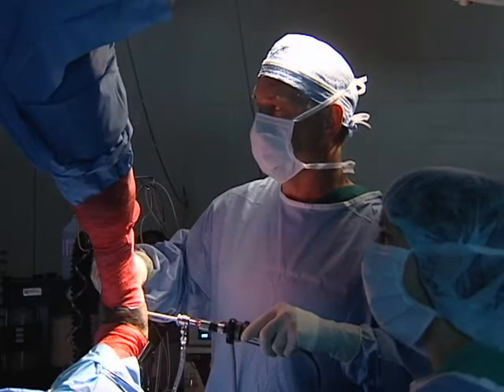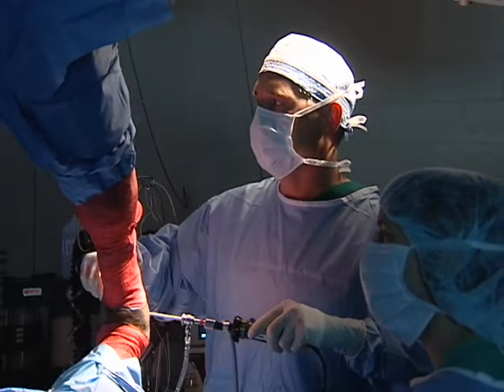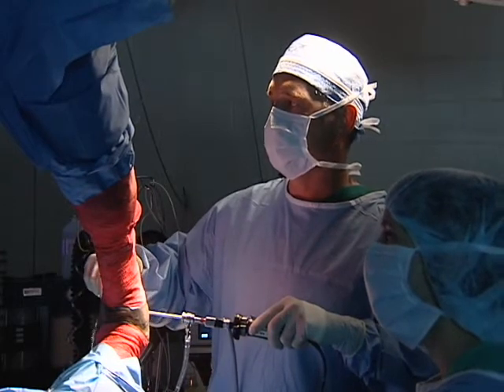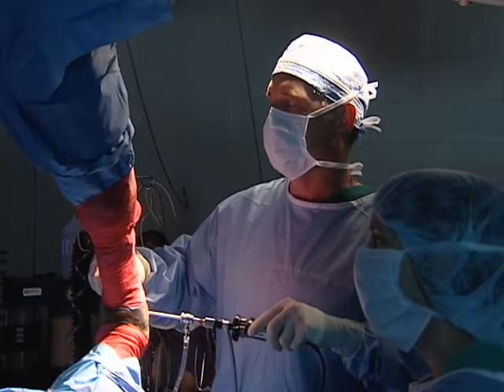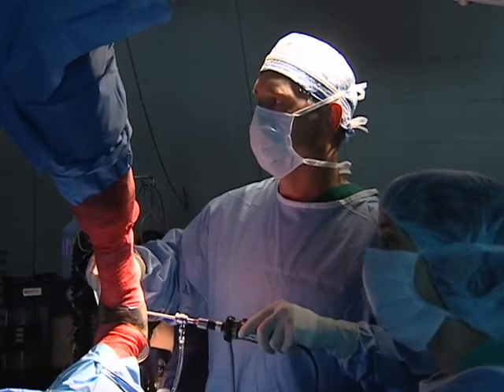This is just abnormal cartilage. All this fuzzy appearance is abnormal. It's cartilage that has been broken down due to, one, that bone fragment that was in the joint, the inflammation, and other changes that have been going on in the joint. And so it's not doing anything of any significance to help support that joint. So we'll remove most of the loose tags. You can see the edge of it where it meets with the more yellow tissue, that's bone, and all of this white tissue is cartilage. You can see along the edge it is still attached, so I don't want to go back any further, and I'm just lightly cleaning this margin up.